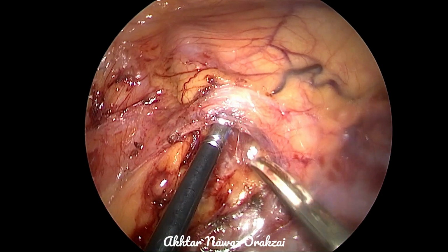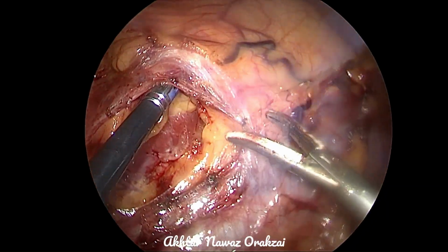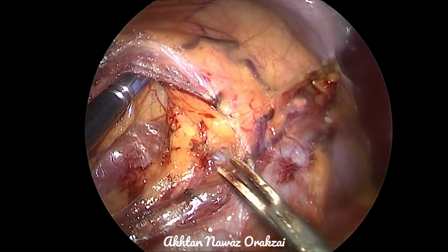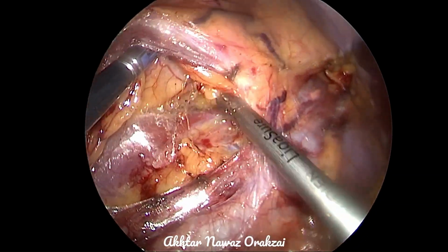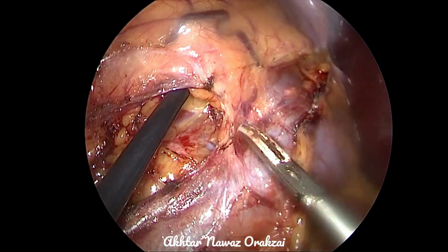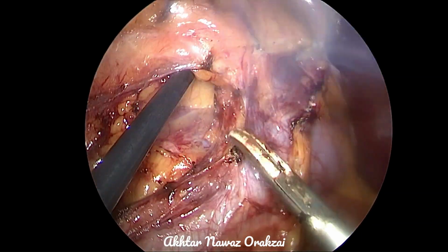Number two, mobilization of the lower pole towards the pedicle is of extreme importance because, as you know, we'll be clamping the pedicle. Good dissection of the pedicle is necessary, and to identify that pedicle and dissect it, it is important to mobilize the lower pole.